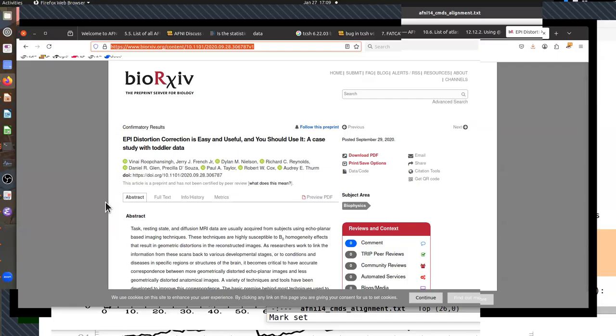That being said, if you're off by a voxel or so in your nonlinear alignment or your skull stripping between the anatomical and template, usually your EPI resolution is so much lower, it might not matter so much in practice. So there's a lot of case sensitivity to some of the answers of these things, rather than necessarily a generality.